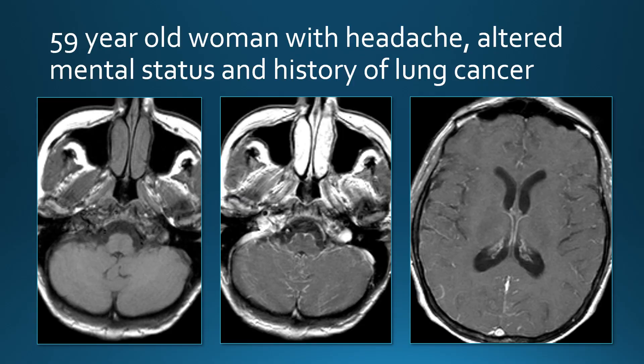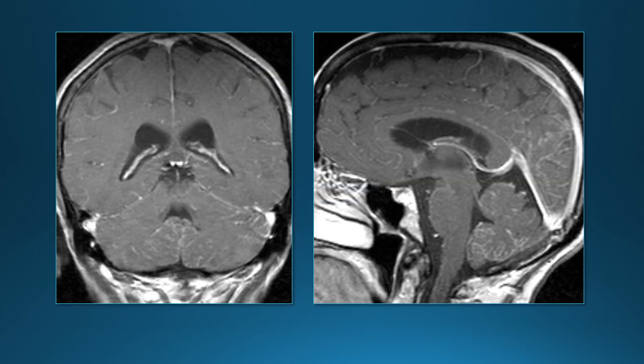This patient has a headache, altered mental status, and a history of lung cancer. This one is a little more subtle — we see some faint leptomeningeal enhancement within the cerebellar folia, maybe within a few cisterns. This is a patient with leptomeningeal metastases from lung cancer. The sagittal images show the leptomeningeal enhancement along the cerebellar folia very nicely. The cerebellar folia is quite a common location for leptomeningeal tumor deposits, probably due to the way the CSF flows.